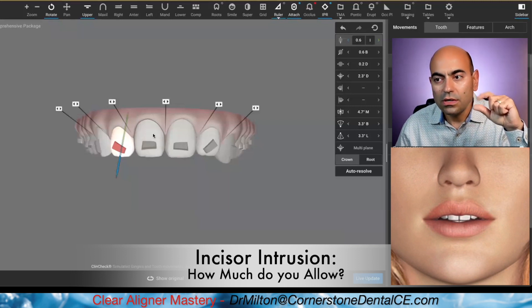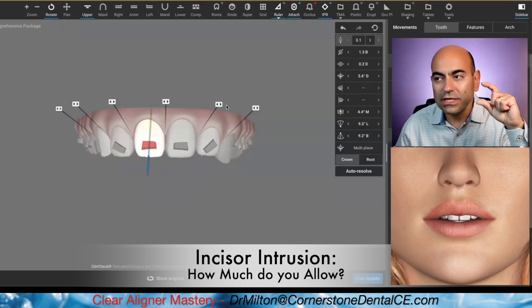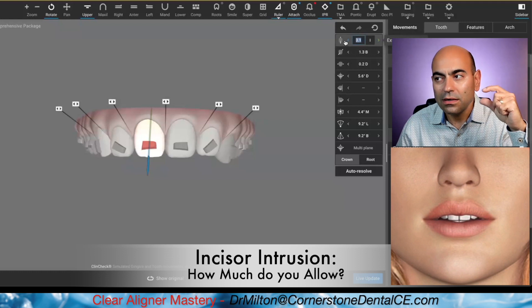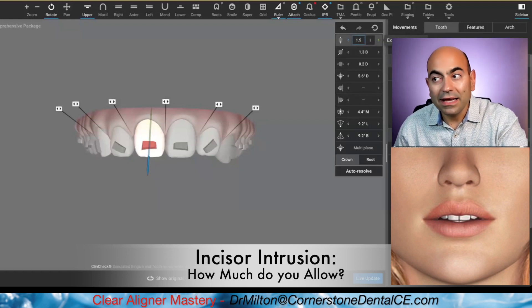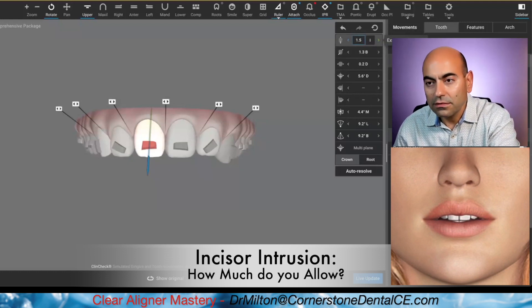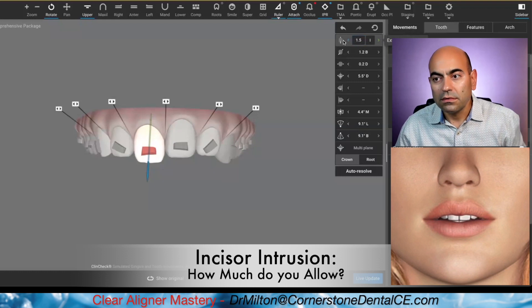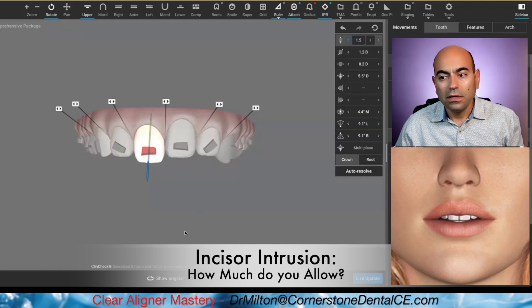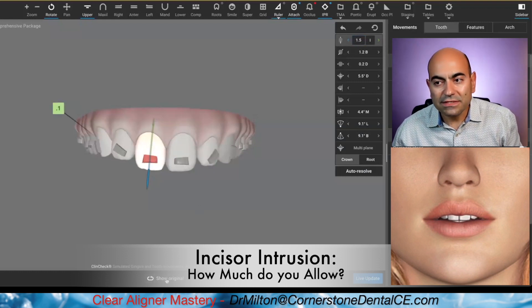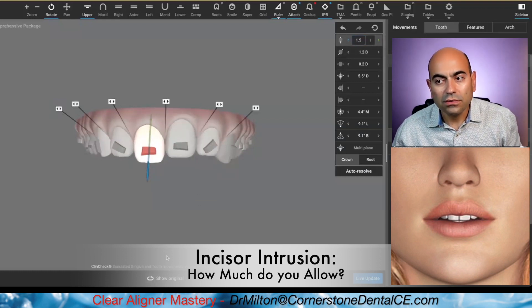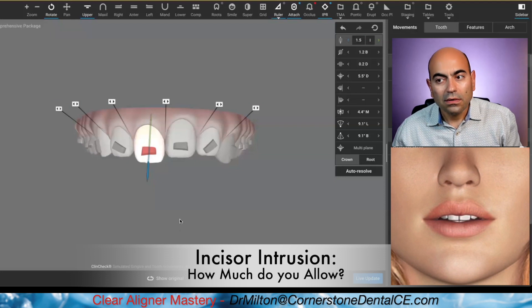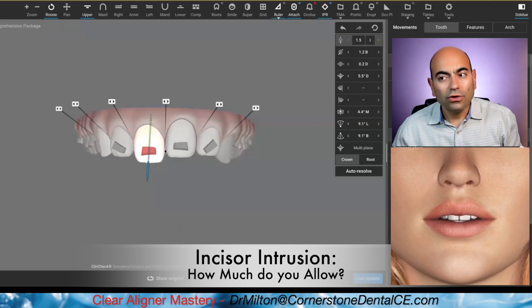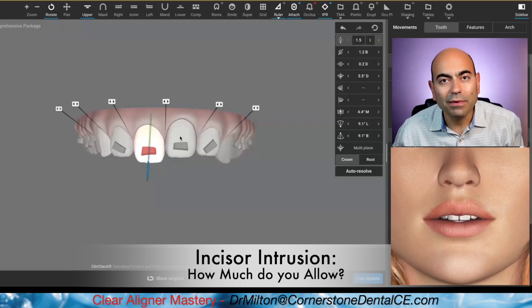So the same thing with the central — 3.1, how about 1.5? I'm cutting it in half. Boom. We still have some intrusion, but I don't have to have that much.